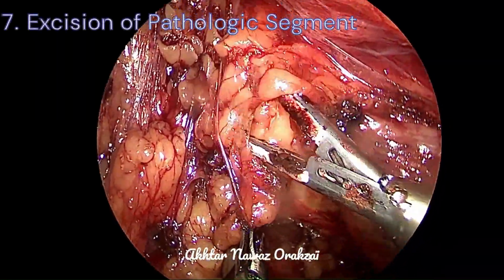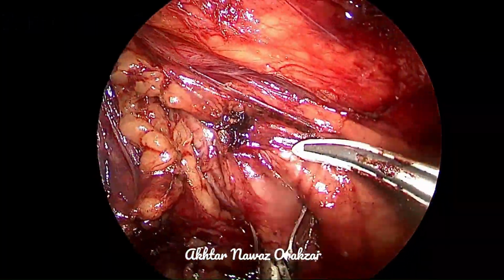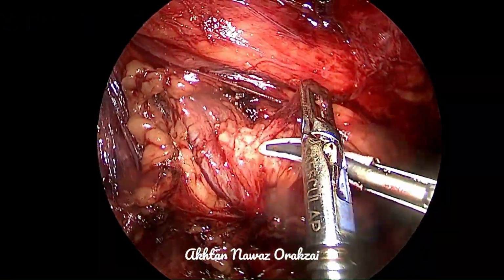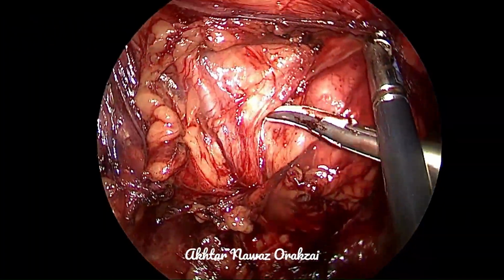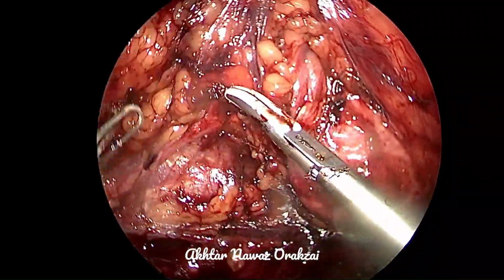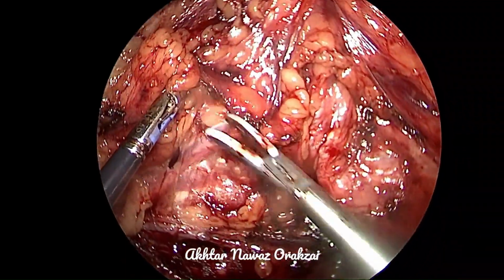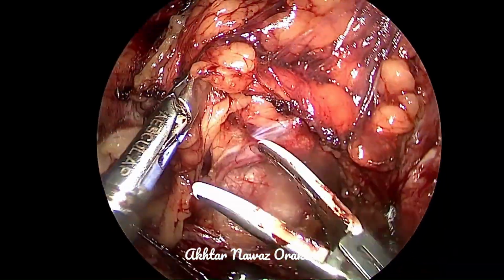And the most important thing is the excision of the pathologic segment. If you follow each and every principle but you do not resect the pathologic segment, there is a fair chance that the pyeloplasty will fail. So the pathologic segment has to be excised.